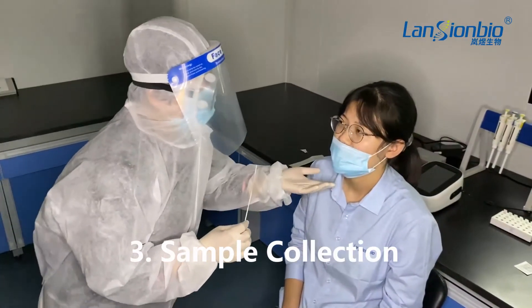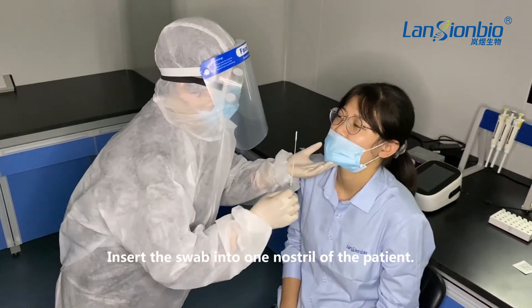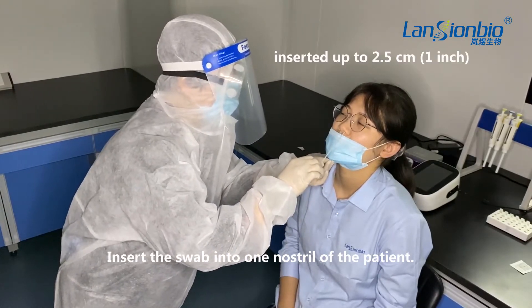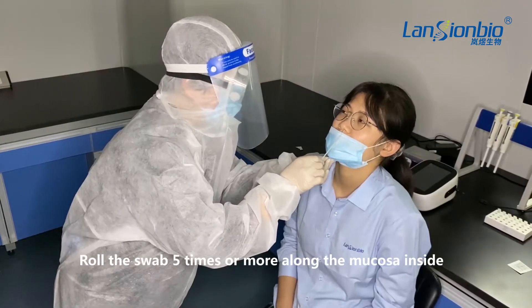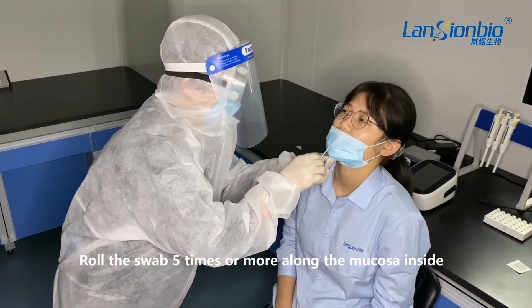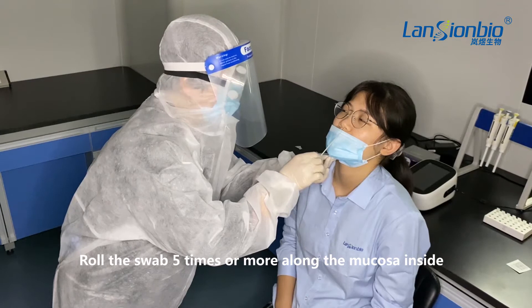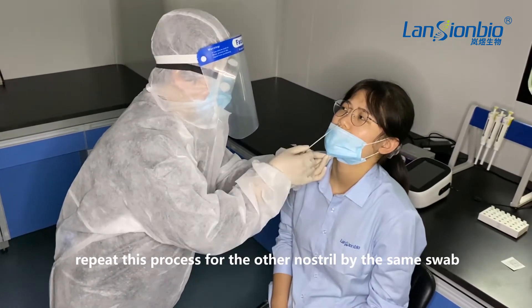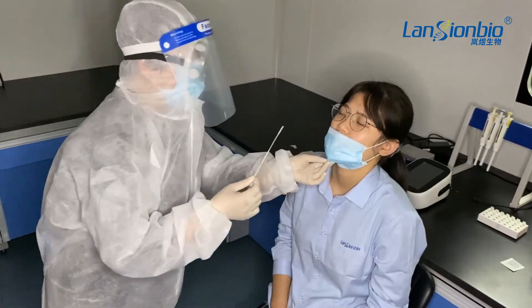Then the sample collection. Insert the swab into one nostril of the patient. The swab tip should be inserted up to 2.5 cm from the edge of the nostril. Roll the swab five times or more along the mucosa inside the nostril. Using the same swab, repeat this process for the other nostril.